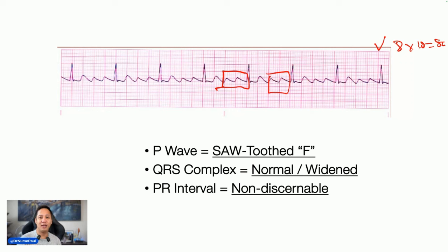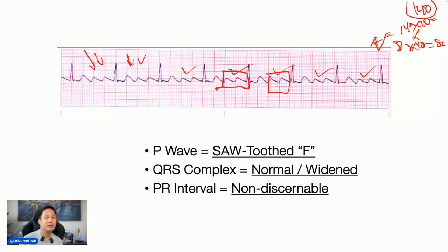Okay, how about the atrial rate? Every abnormal P that you see is an atrial beat. 1, 2, 3, 4, 5, 6, 7, 8, 9, 10, 11, 12, 13, 14. What's the atrial rate, guys? Sorry, my screen is acting up. 140. Agree? I counted all the P's. It's still P, it's just abnormal, right? So what do you guys think?